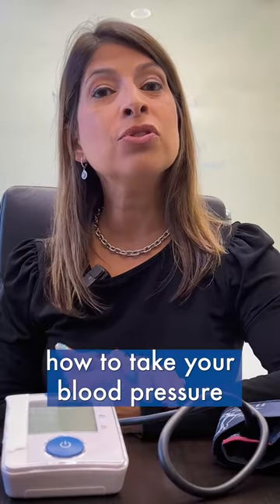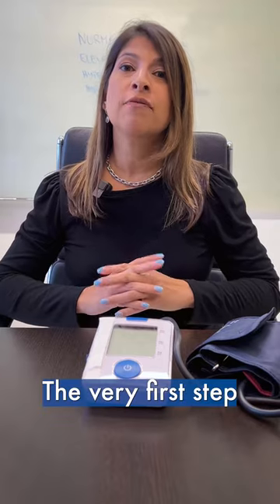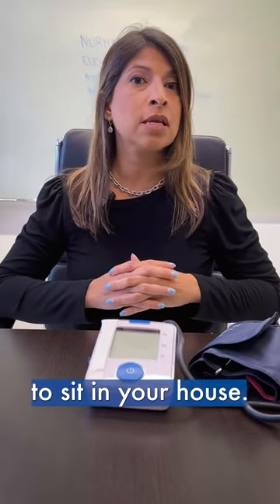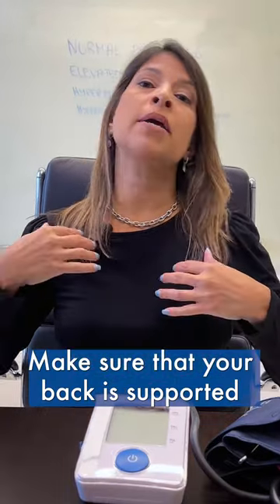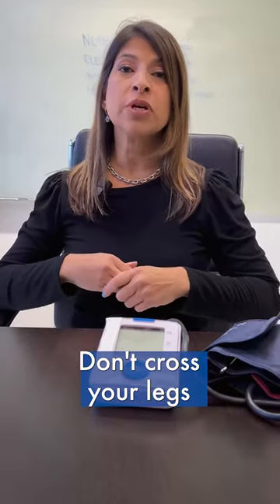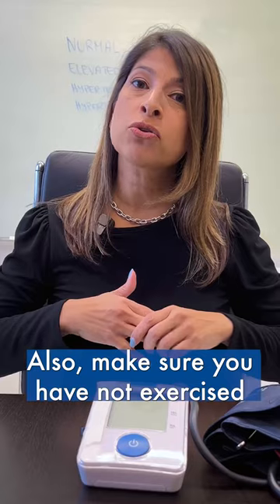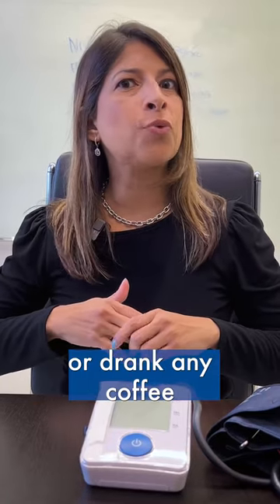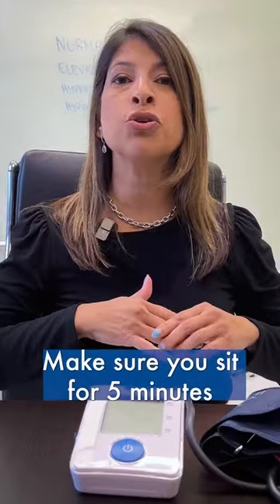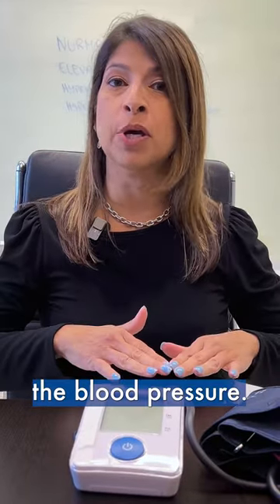Today we're going to talk about how to take your blood pressure at home. The very first step is to find a comfortable place to sit in your house. Make sure that your back is supported and your feet are both flat on the floor. Don't cross your legs while taking your blood pressure. Also make sure you have not exercised or drunk any coffee 30 minutes before taking your blood pressure. Sit for five minutes before starting to measure.